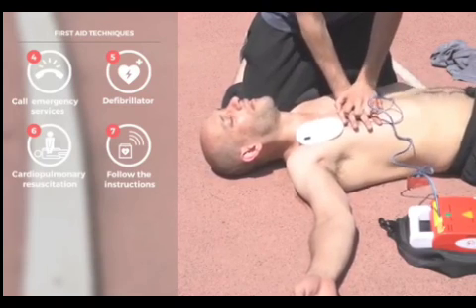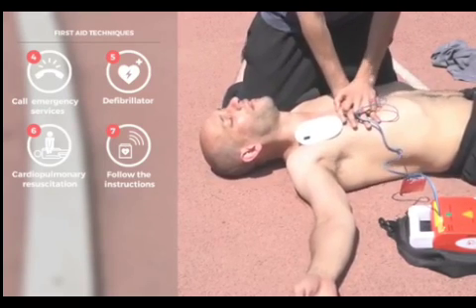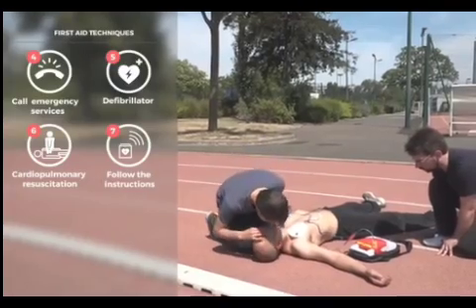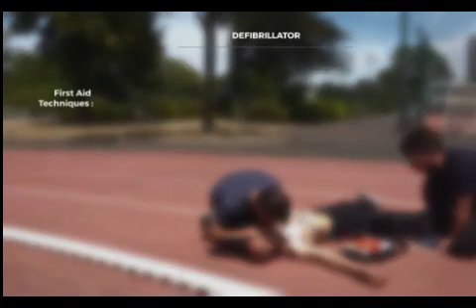This device can even be used on children and infants, normally with a special adapter or using pediatric electrodes. In the absence of these adapters or special electrodes, an adult defibrillator can be used. Place one electrode on the chest and the other on the back at the level of the chest.